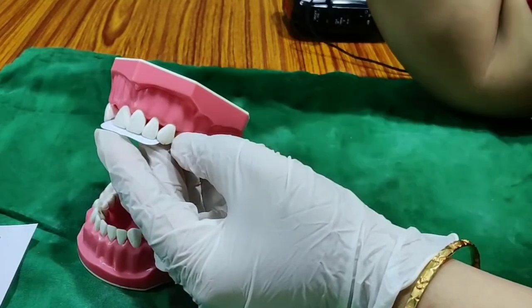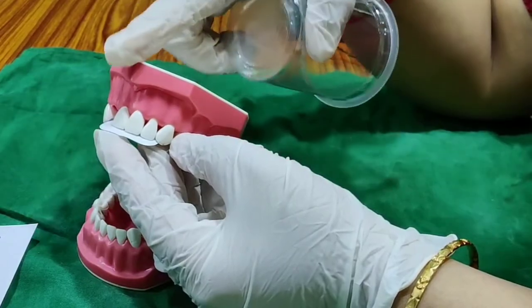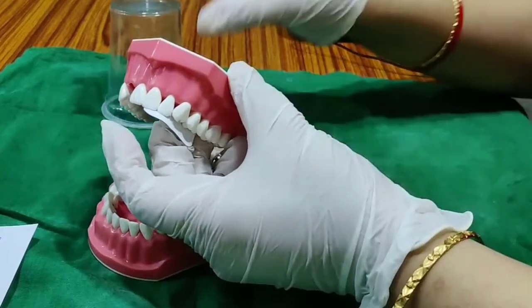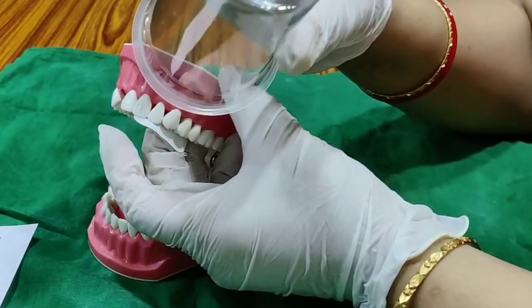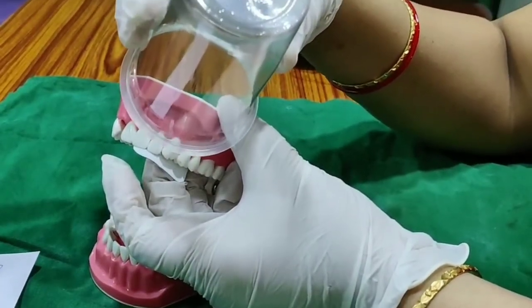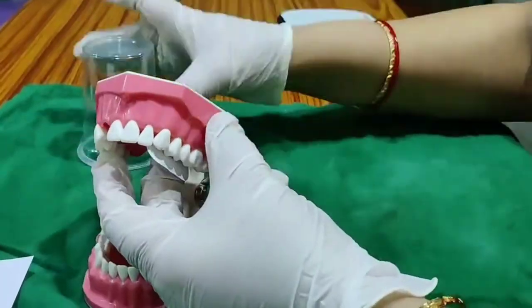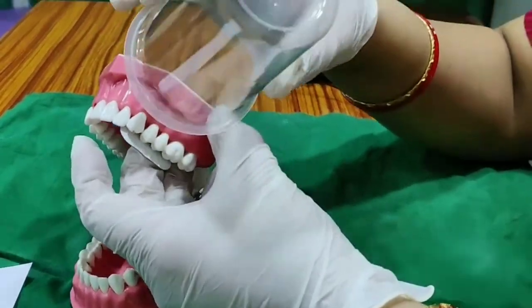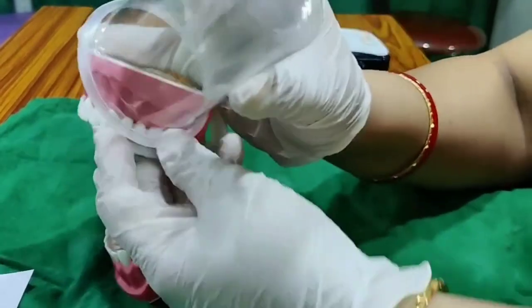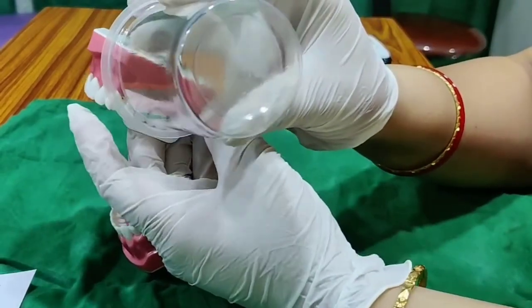For every patient during X-ray, imagine the ala-tragus line and place the cone. For the canine, place the cone at center with angulation of 45 degrees. Increasing the angulation moves the cone upward; decreasing moves it downward — adjust accordingly and focus. For premolars, the angulation is 20 degrees — change to 20 and focus on the premolar region along the ala-tragus line. For the posterior molar (tooth 6), the angulation reduces to 10 degrees. Gradually it reduces from 45 to 10.